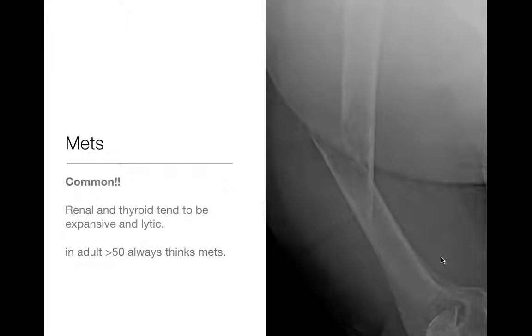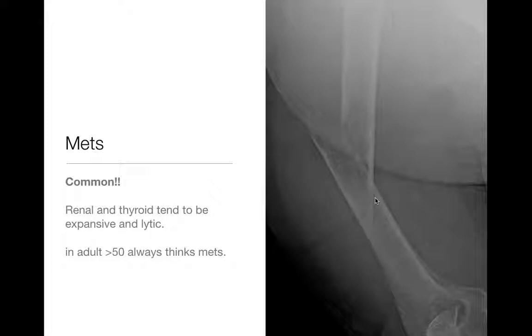Metastasis — very common. Please think of metastasis especially in adults over 40 or 50, or if they have a known history of malignancy. They can look benign. Metastases that tend to be expansile and lytic are renal and thyroid metastases — those are the common prototypes. Here's a geographic lytic lesion with a pathological fracture through it — this was a breast metastasis, but renal and thyroid are the two prototypes for expansile lytic metastases.